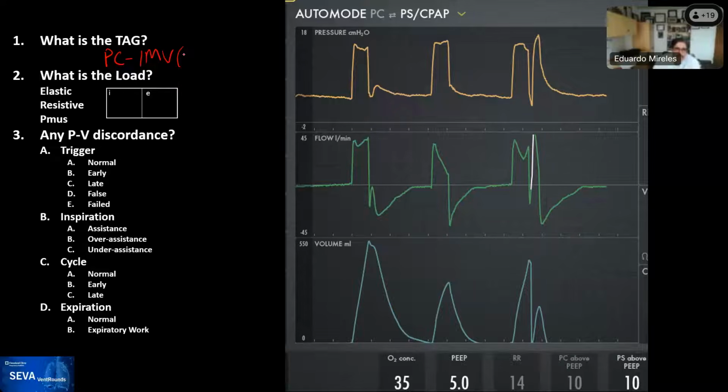And we're going to talk a little bit more on this breath sequence, this mode. Rob and Ariel have just published the article on how this mode in particular works, and we'll ask you to speak a little bit about this.